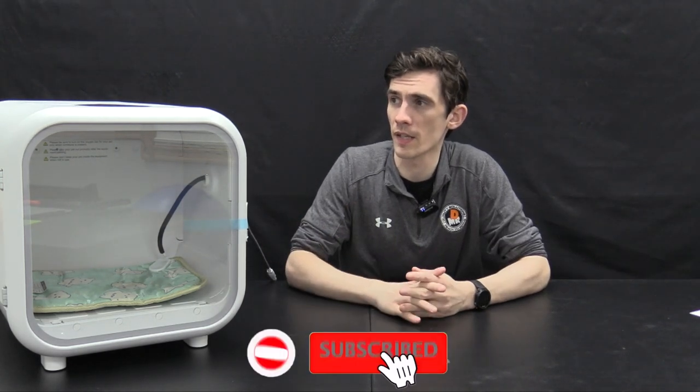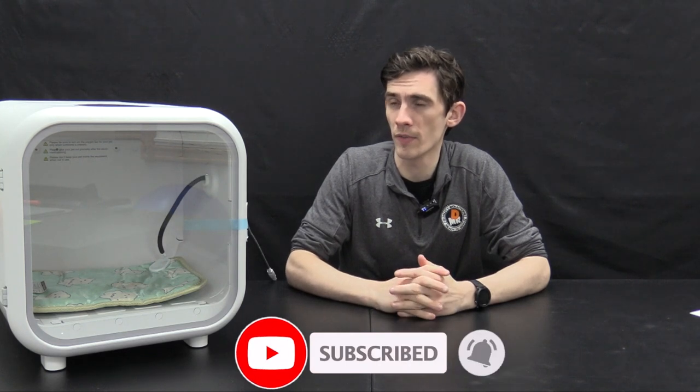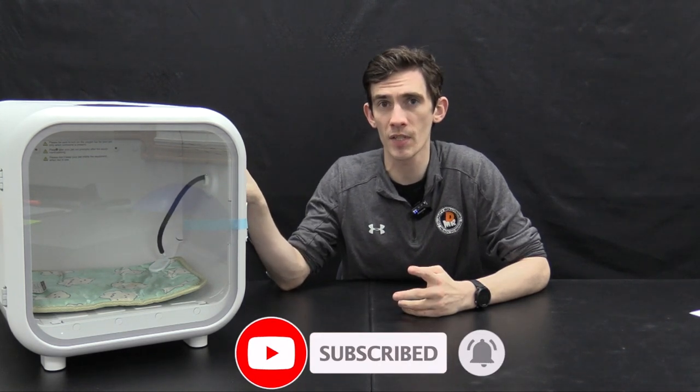Hey and welcome back. I'm your host Sam with K9P4. Today we have an exciting product for you — the PET oxygen chamber. This thing has a built-in oxygen concentrator conveniently located inside the back of the machine. It comes all in one piece. You do not have to assemble or add on oxygen — it's all there and all ready.